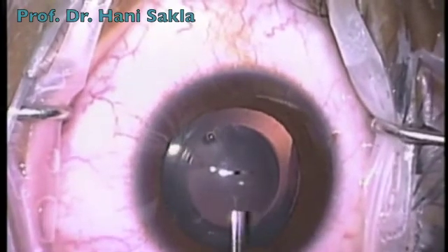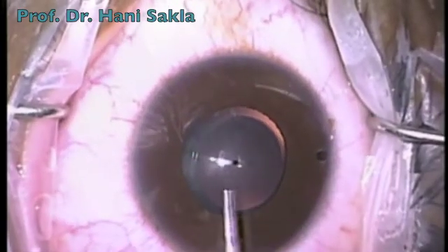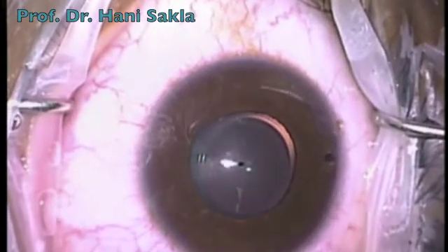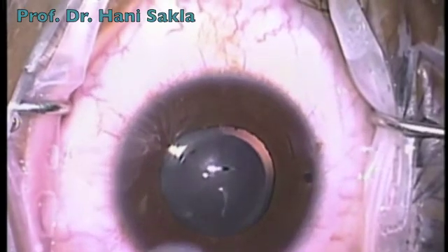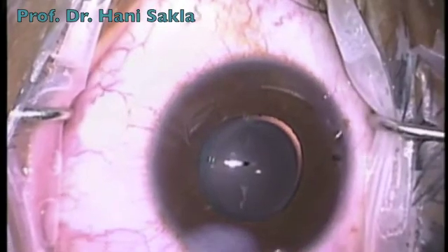Then we wash the viscoelastic with BSS by injecting BSS inside the anterior chamber and gently pressing at the lip of the wound. Most of the viscoelastic will leave the anterior chamber. Then we hydrate the incision to make sure that the incision is watertight.